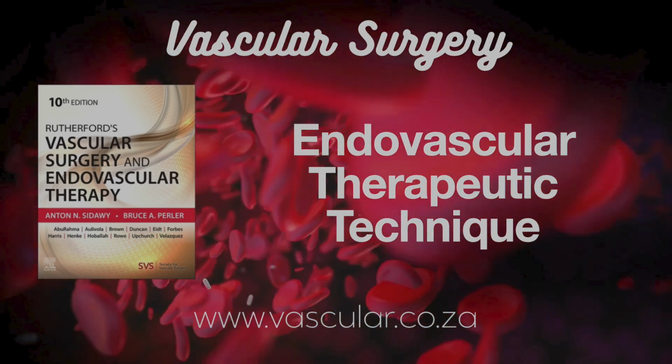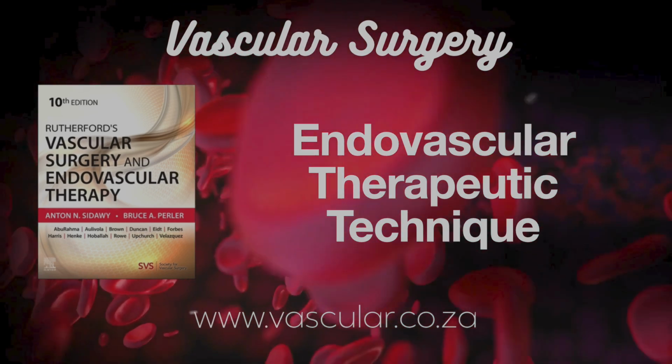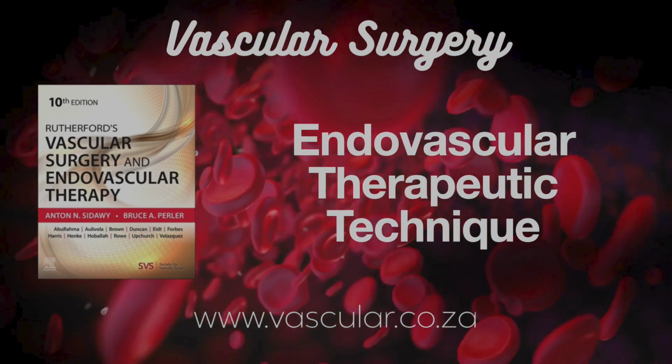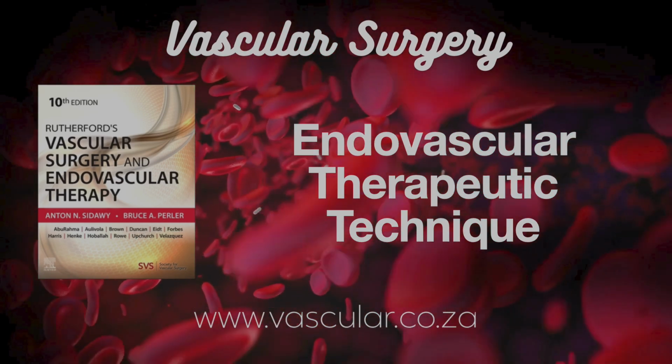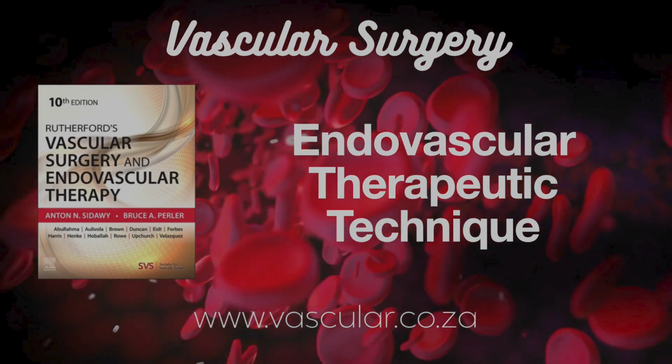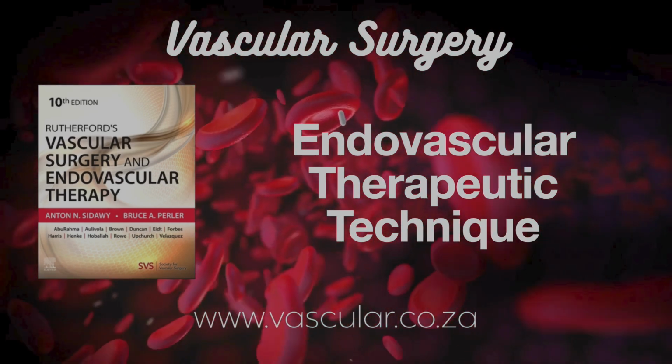Advantages and disadvantages of BES in peripheral arteries. The big advantage is their rigidity once deployed. Great resistance to that elastic recoil we talked about. They also allow for very precise placement, and they tend to show up better on X-ray, more radiopaque than some SES.